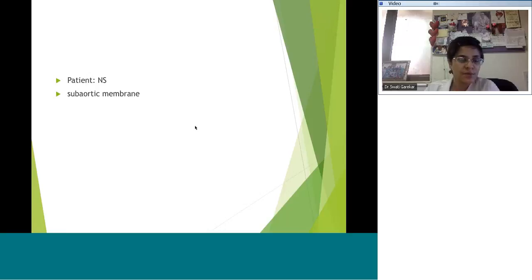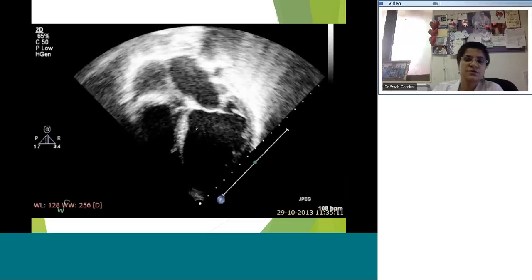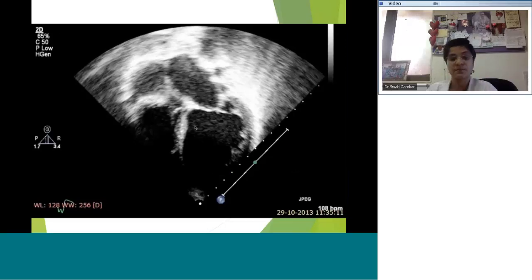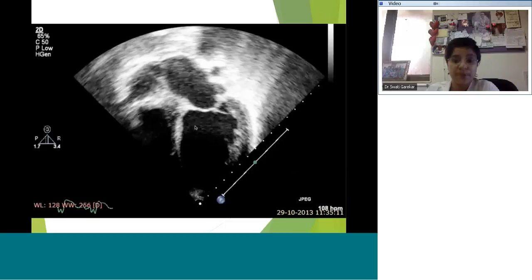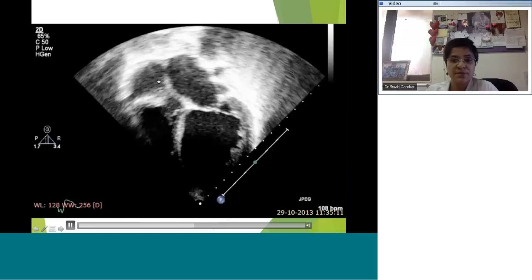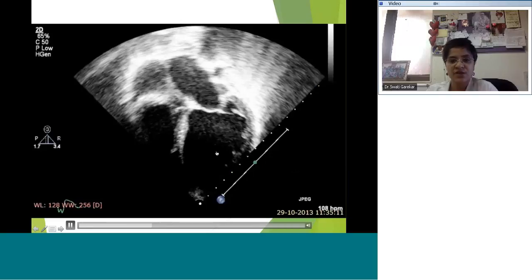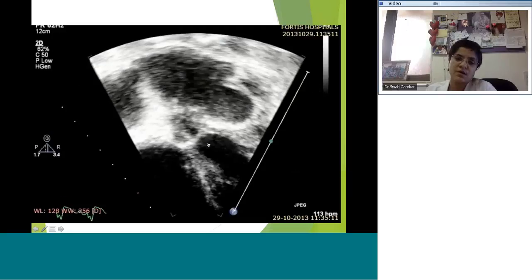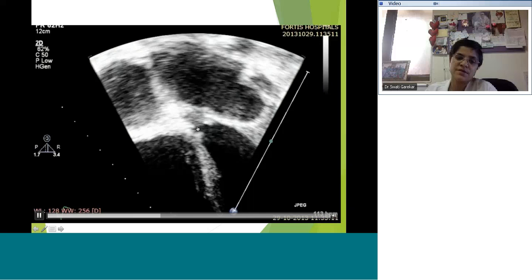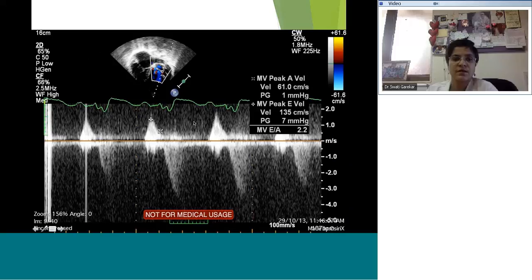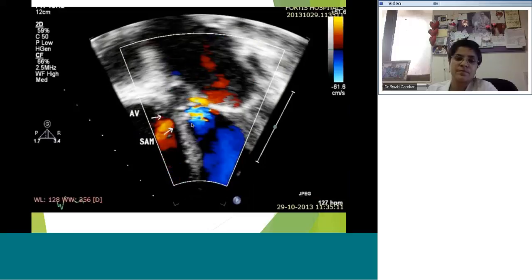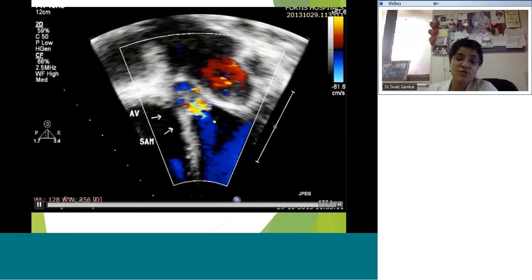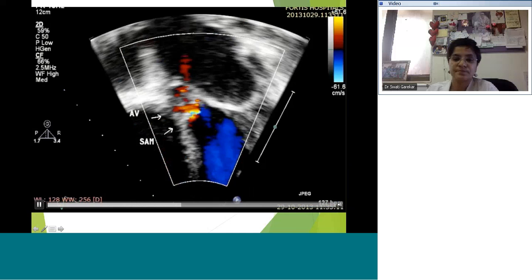Moving on to a patient with a sub-aortic membrane — an 11-to-12 year old. In the apical four chamber view, the atrial septum going into the right atrium is visible, the left atrium is enlarged, and we're not happy with LV function — the LV also looks enlarged. We concentrate on the aortic valve — opening and closing. This is a case of a sub-aortic membrane: that's the aortic valve cusp, and proximal to it is a membrane — a sub-aortic membrane.